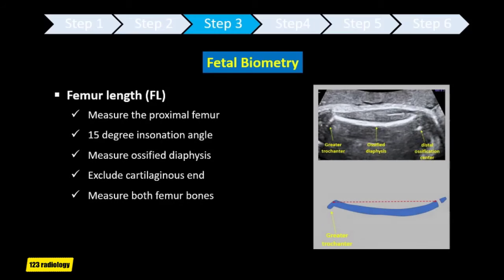The femur length can be reliably used after 14 weeks of gestation. Usually we measure the proximal femur to the probe. You have to see both cartilaginous ends and measure the longest axis of the diaphysis, without including the distal femoral epiphysis. Ideally, measure both femurs.